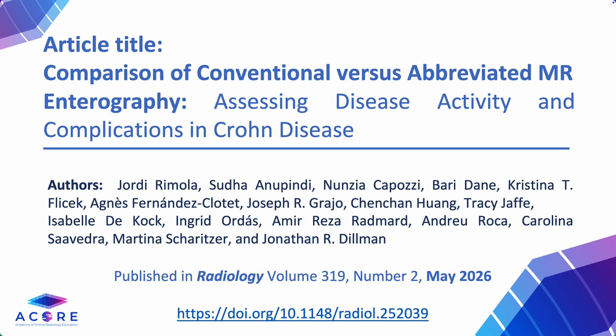The paper is "Comparison of Conventional Versus Abbreviated MR Enterography Assessing Disease Activity and Complications in Crohn's Disease," published in Radiology in May 2026, and a special credit to the investigator team for a well-designed, carefully executed study.